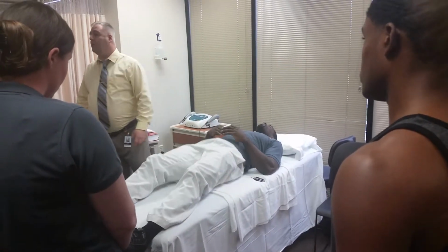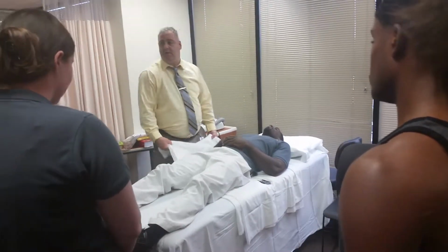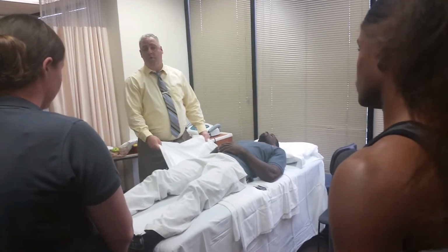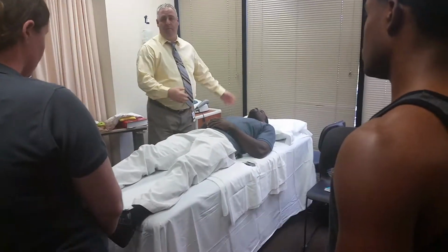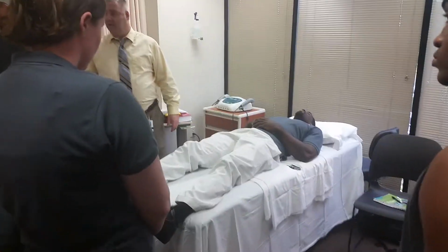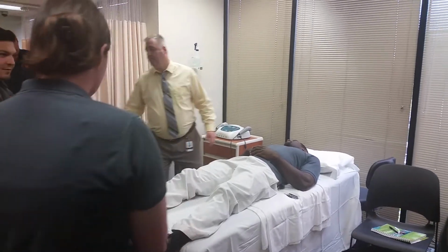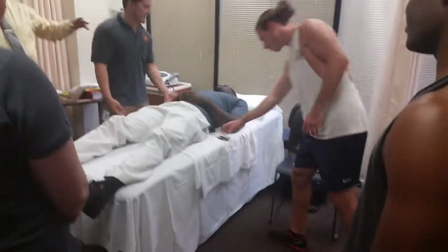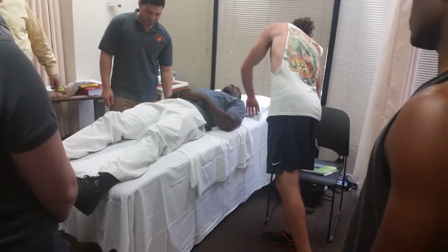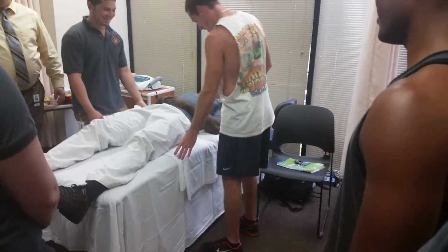The other way to do it is a two-person move where we're using this draw sheet to help him go back up in bed. So, Gabe, I'll have you on one side and pick another classmate to help you. Sean. Okay. We need to appoint one leader. Who's going to be the leader? I'll be the leader. All right, Gabe is the leader.